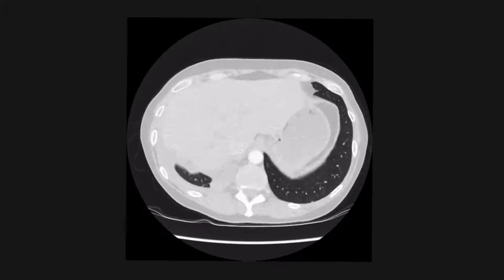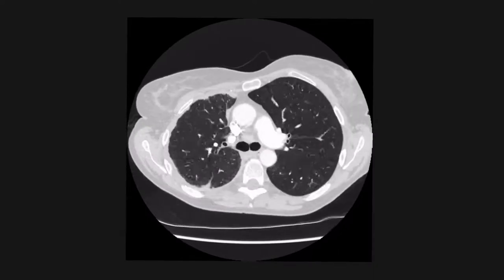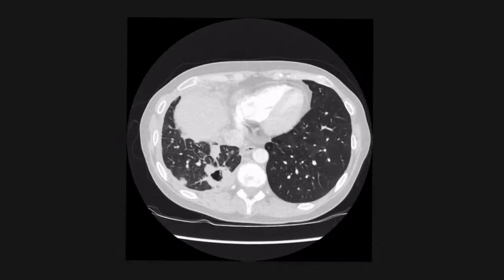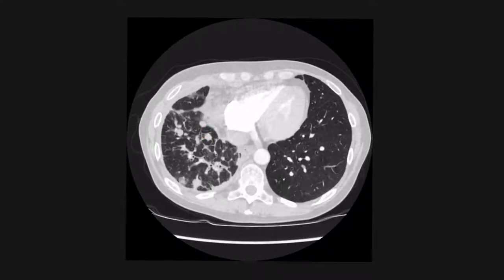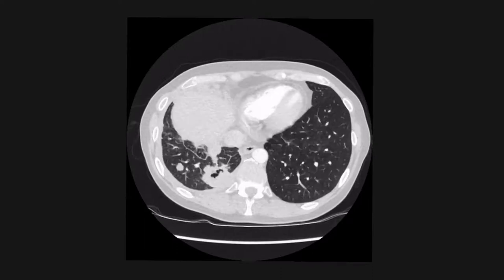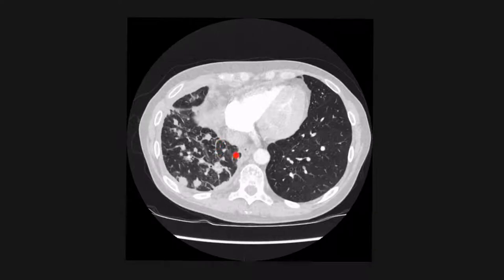Looking at this first CT chest example, the right lung is grossly abnormal. There is a soft tissue density lesion in the right lower lobe which also has some gas density within it, in keeping with a cavitating lung lesion. Around this abnormal lesion there are multiple further nodules particularly in the right lower lobe, some interstitial thickening, and a pleural effusion. This is in keeping with a primary squamous cell carcinoma with multiple metastases and lymphangitis carcinomatosis. You would also look for PEs, nodal disease, bony metastases, and liver and adrenal metastases.